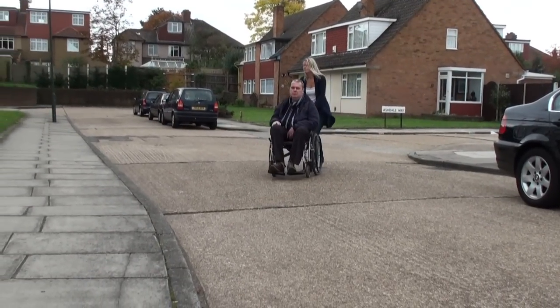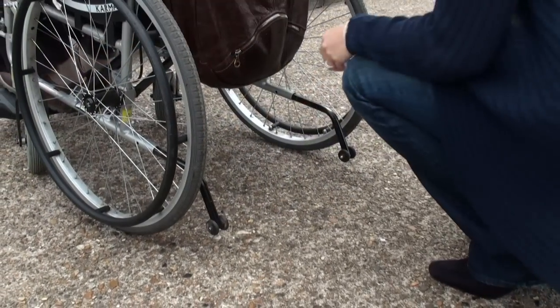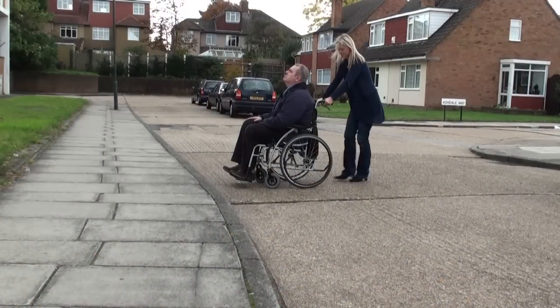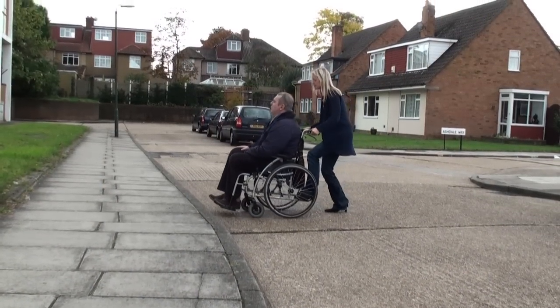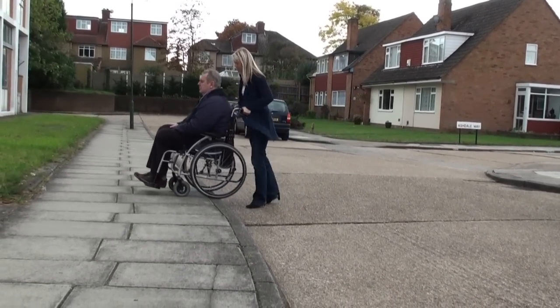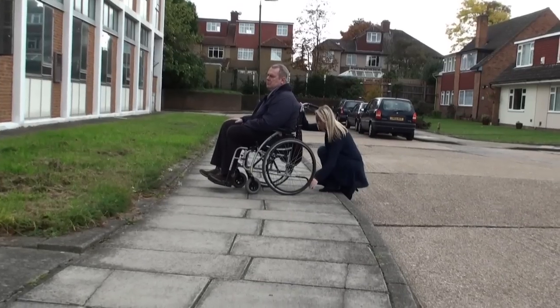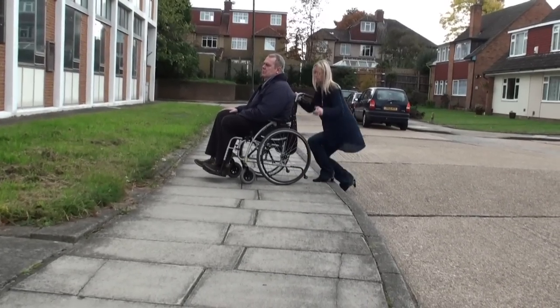You can apply a foot to the back stabilisers to slow the front of the chair down as it lowers. If you need to bring the wheelchair up a kerb and you have the strength to do it, ensure the stabilisers are turned upwards to allow the chair to tilt further back. Once the front of the chair is resting on the pavement, lift the back of the chair up and push forwards. Once safely on the pavement, ensure you turn the stabilisers back into their normal position.